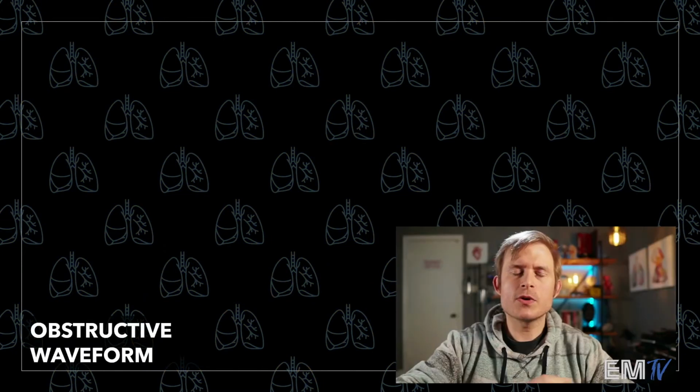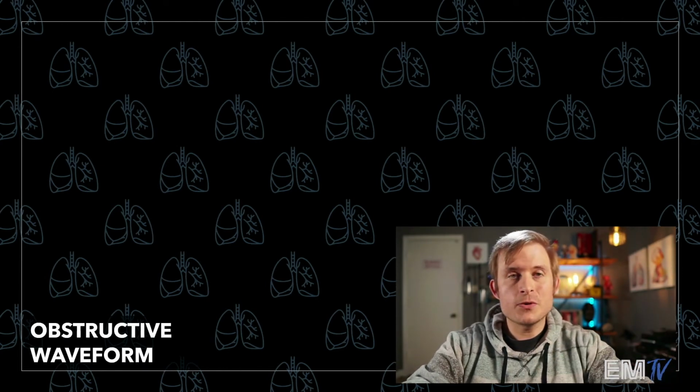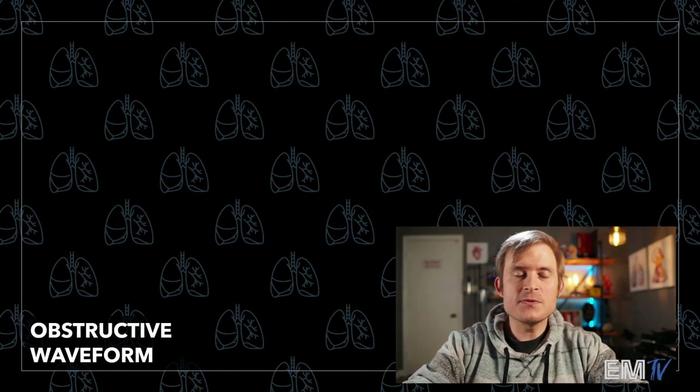Now, the next waveform that we'll talk about is the obstructive waveform. Now, the obstructive waveform is one of those things that is very, very, very reliable in determining the severity of certain respiratory illnesses. In particular, obstructive illnesses like asthma.